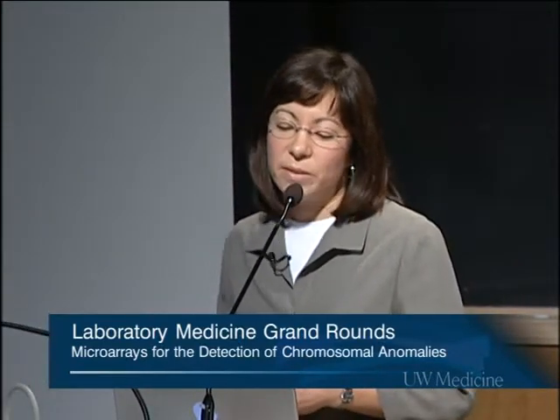But practically speaking, this technique really never gained widespread use in the clinical lab. The SKY instrument is very expensive. The probes are expensive, and it's somewhat of a cumbersome, lengthy technique to perform. And there's really only a limited number of scenarios that we would use it in. So we have a SKY system over at Children's, and we probably only use it a handful of times a year now, primarily to try to characterize marker chromosomes that we see. And there's other ways that you can do that. So there aren't a lot of clinical labs that are using this to any great extent now.